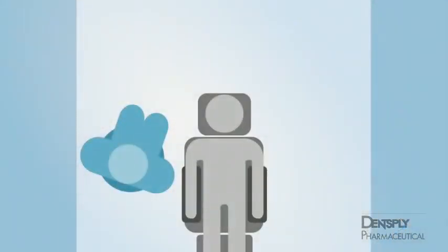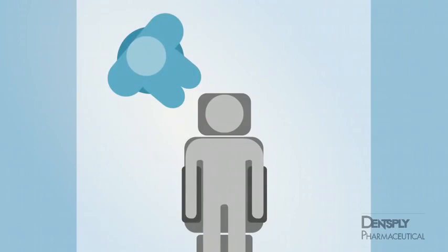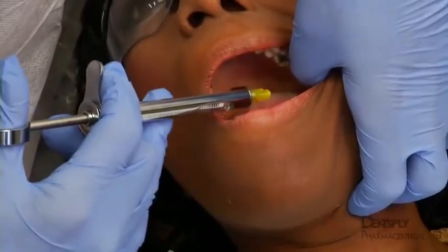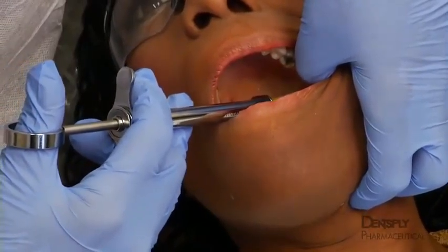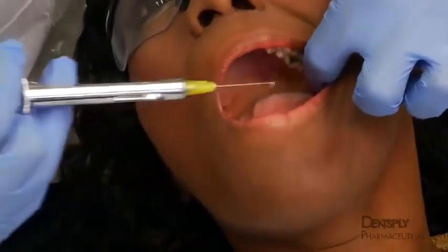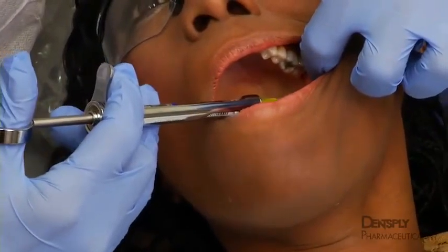For the right-handed operator performing a nerve block of the right mandible, the clinician should be seated in front of the patient with the patient's head turned to permit visualization of the oral cavity. For a right-handed operator performing a nerve block on the left mandible, the clinician should be seated behind the patient in the 11 o'clock position. The left thumb or a dental mirror is then used to expose the site of injection. Should placing the thumb in this manner prove awkward, the index finger may be used instead. Mirror images of these operator positions are used for the left-handed clinician.